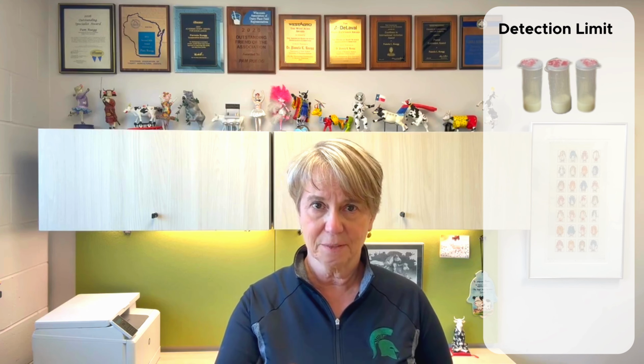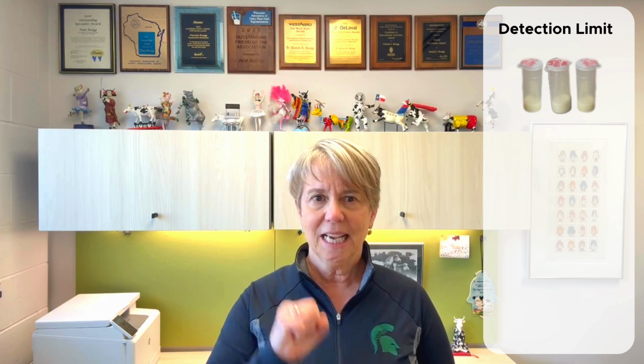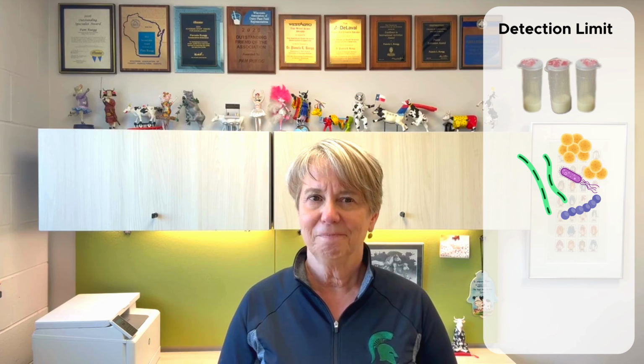Now, to understand how to interpret these samples, there's a few things we have to think about. First of all, what is the detection limit? By detection limit, I mean, if we have a milk sample that we take from a quarter that has mastitis, and we take it to a lab, how many bacteria have to be in that milk sample in order for us to detect it?